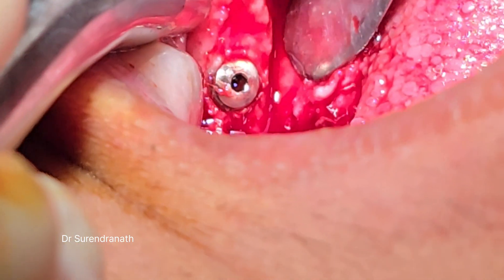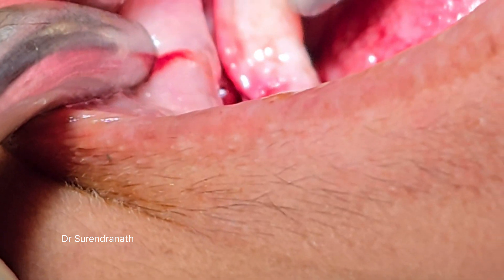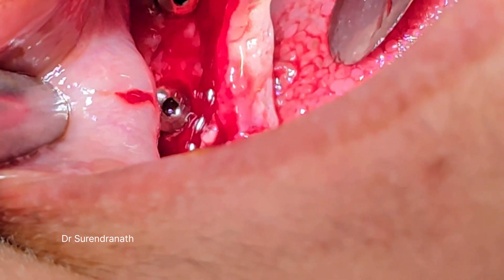Here are some implants. This is the envelope flap — now we are going to close it like this and suture it.